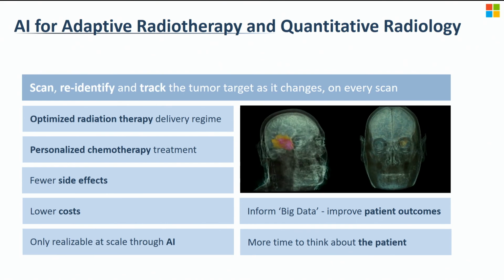So you can track tumor progression over time. You can do things like adaptive radiation therapy, where an AI system would actually look at how the tumor responds to a radiation treatment in real time between sessions, and would adjust the treatment based on that. Right now they build one plan, the one that I've shown you, and they use that plan pretty much unchanged through multiple sessions of therapy, and the tumor obviously changes. So there are a lot of things that we can do to improve that.